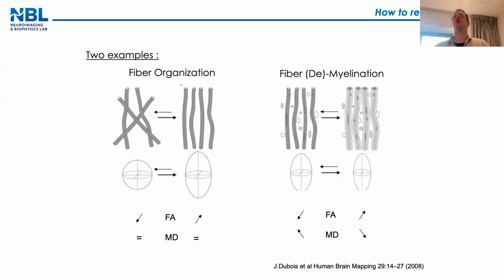It's important to understand that when we talk about diffusion, we are not looking at a molecular staining of myelin or a molecular staining of neurons, okay? If you're familiar with histology, you have staining that's specific to proteins, specific to antibodies, etc. Diffusion is not specific. That is one of the big complaints many people have about diffusion: it is aspecific.